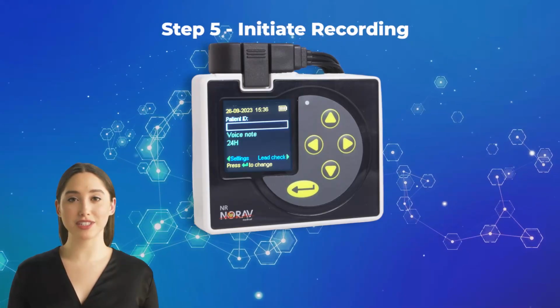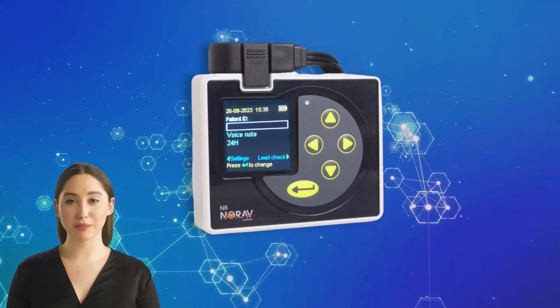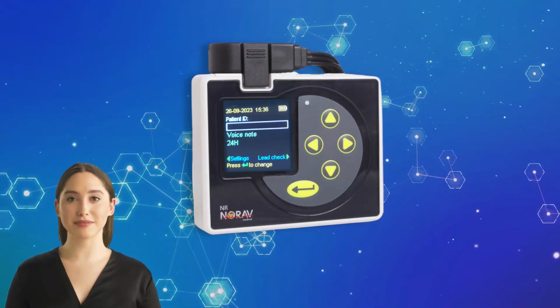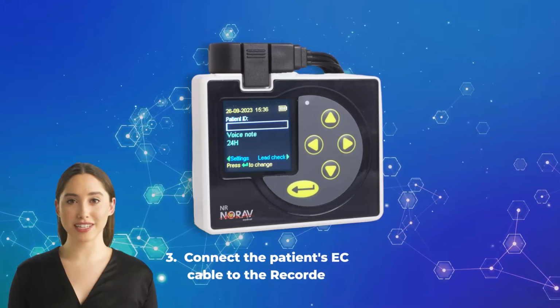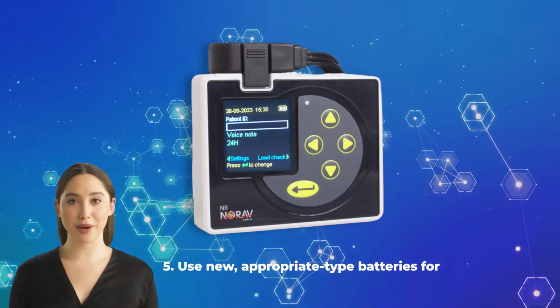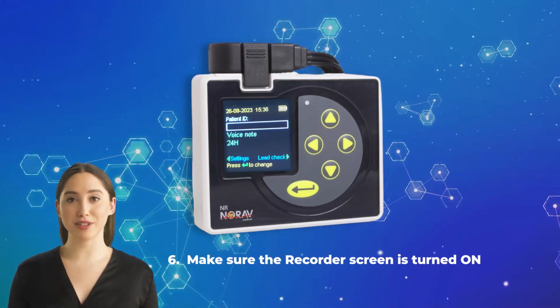You're now ready to initiate recording. Follow the steps based on the connection method you have used to prepare the recorder. If you have prepared your recorder using USB, disconnect it from the USB. Detach the USB cable from the recorder. Connect the patient's ECG cable to the recorder. Insert a new battery into the recorder and turn it on. Use new, appropriate type batteries for each test. Make sure the recorder screen is turned on.